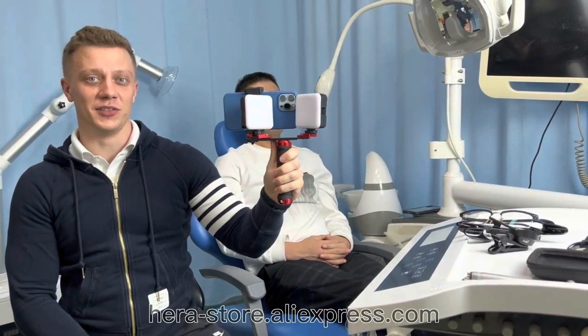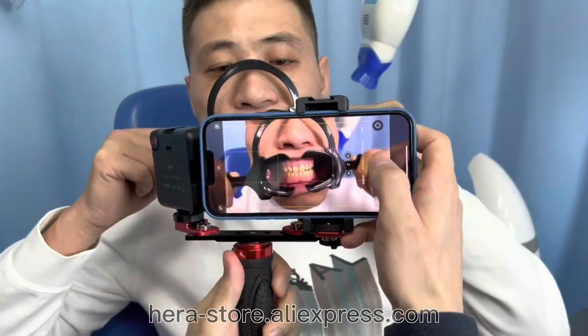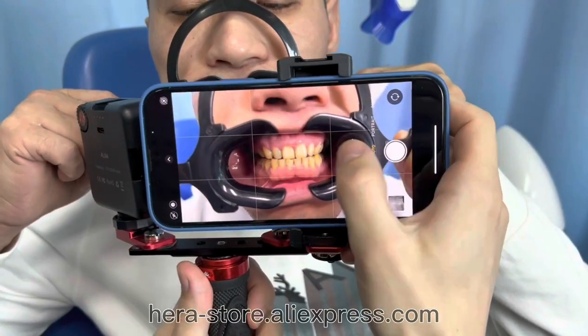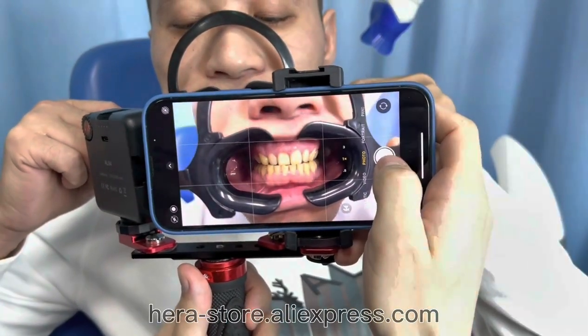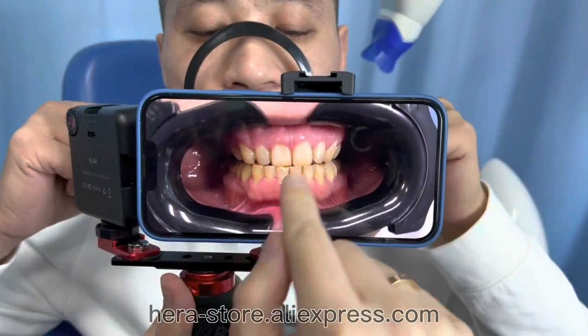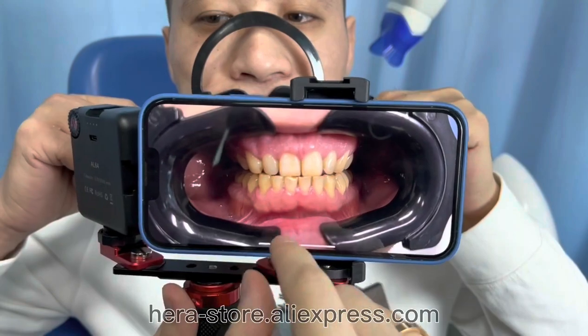Now let's see it in use. First, as you can see, I don't turn on the light so we can see the difference. Let's take the first photo. You can only see the front teeth — the light is not sufficient to see the back teeth.